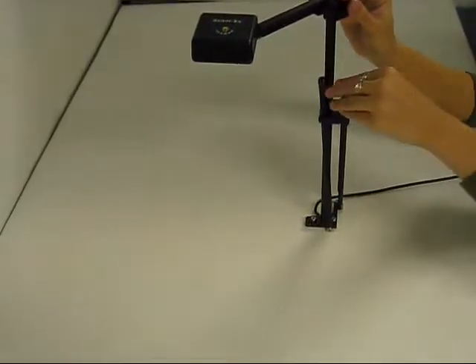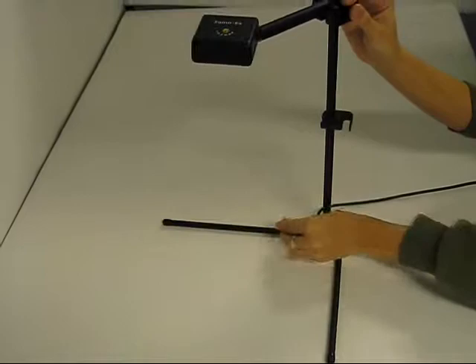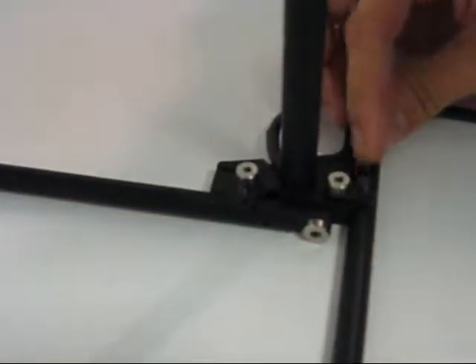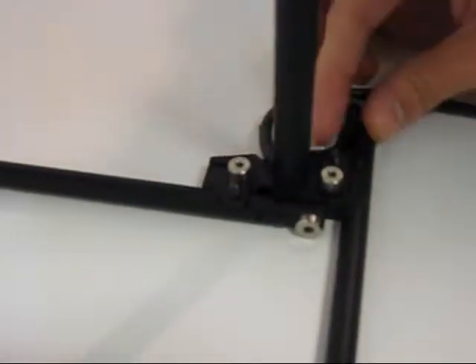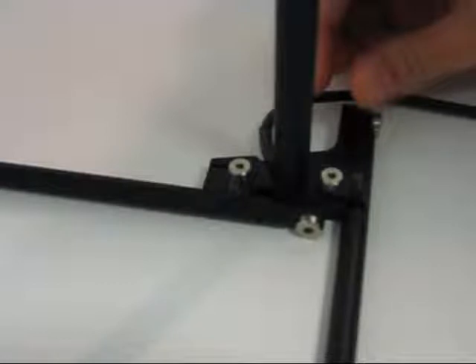Step 2. Gently fold down each of the two ZoomX legs. Then, rotate the leg locks into their final positions. You will hear a light clicking sound. This sound is an indicator that the legs are in their secured positions.